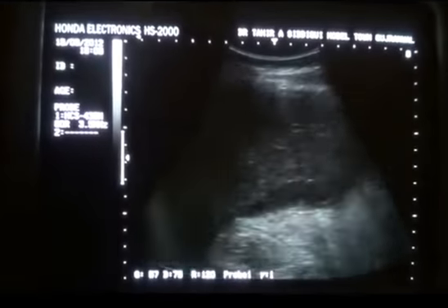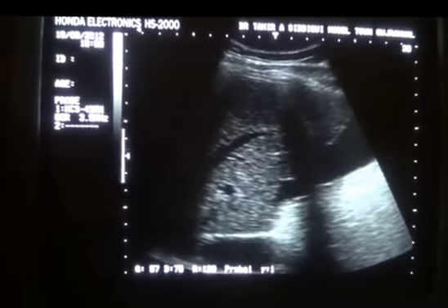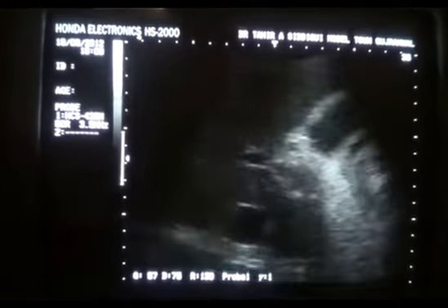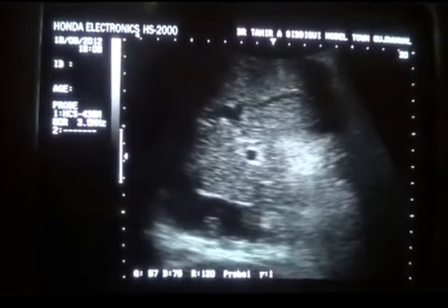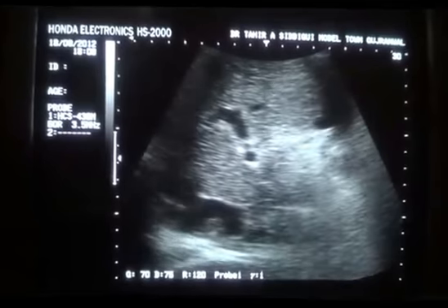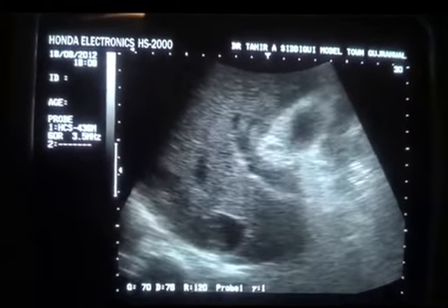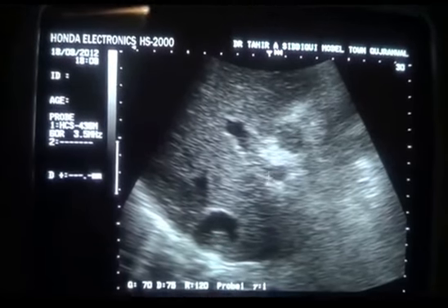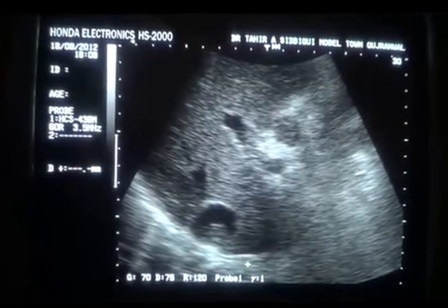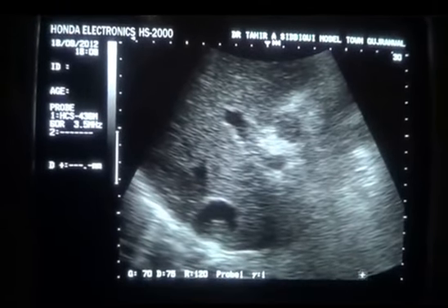Coming again to the same pathology that I mainly wish to show you in this study, the formation of a clot within the IVC. Now, this is the transverse section. This is the transverse section of the IVC. This is the clot within the IVC. This is the portal vein, the liver, and this is the right hemidiaphragm.